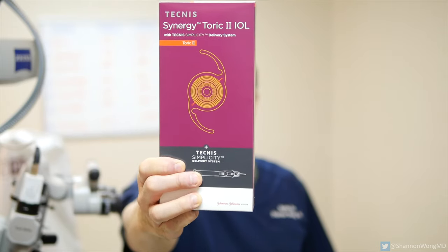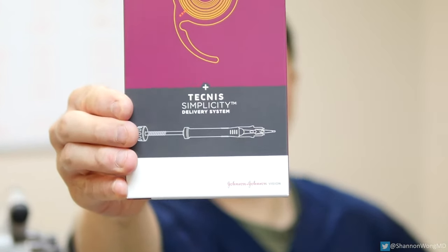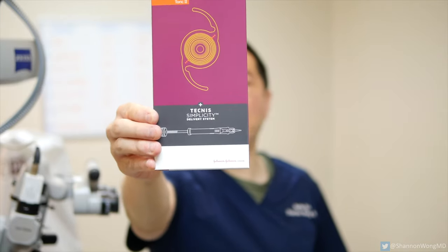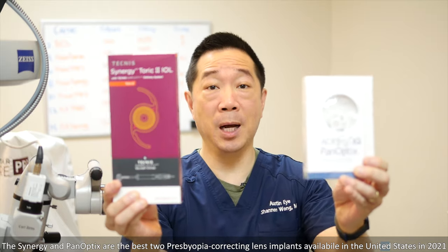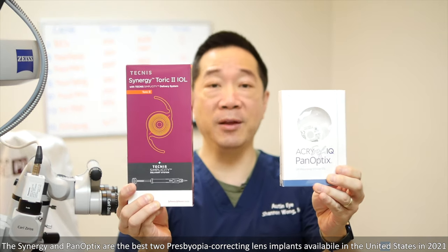This week we started using the very latest generation presbyopia correcting lens implant called the Synergy Lens Implant. This lens is made by Johnson and Johnson Vision and it comes pre-packaged in what they call the Simplicity Delivery System. The Synergy is a direct competitor to the Panoptix lens made by Alcon, and in my opinion these are the best two presbyopia correcting lenses available and FDA approved in the United States.